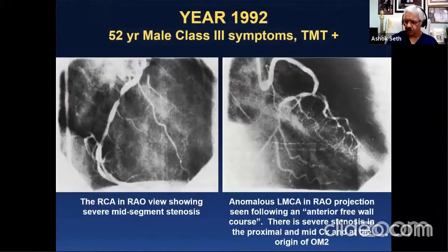Let me take you to this, a very interesting throwback from 1992. It also gives you a flavor of what we went through 30 years ago, when there were no stents, when there was very basic antiplatelet therapy with aspirin, persantin, and dextran, and where the surgeons would stand on our back all the time with an empty theater, telling us that we needed to finish the angioplasty so that they could start their cases. They would allot time for an angioplasty because the theater would have to be standing by.